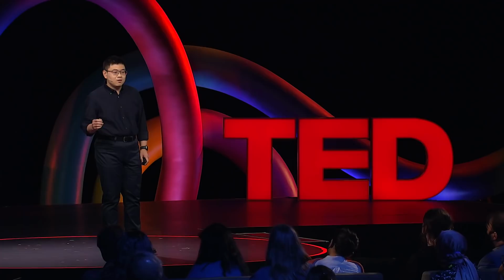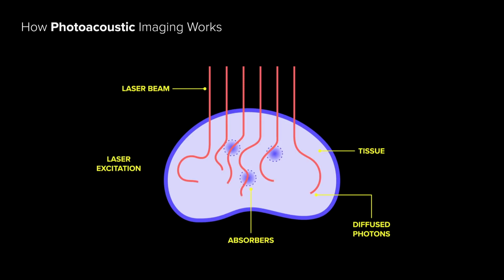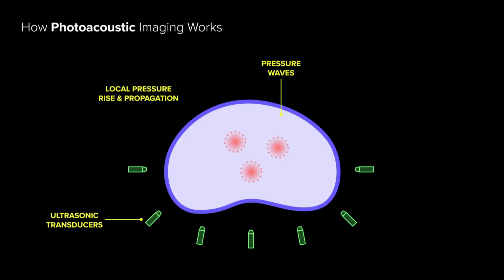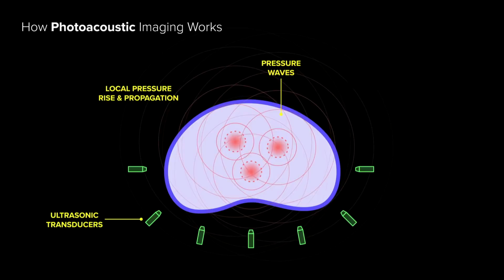So, what is photoacoustic imaging? Based on the photoacoustic effect, it is a conversion of light energy into sound energy. We shine a gentle laser pulse onto the tissue. The light is absorbed, raising its temperature a bit. The rise in temperature leads to a tiny fraction of volume expansion, which in turn generates acoustic waves. Sensors process those sound signals, resulting in a high-resolution image whose level of clarity and detail far surpasses what you get with traditional CT scans or ultrasounds.